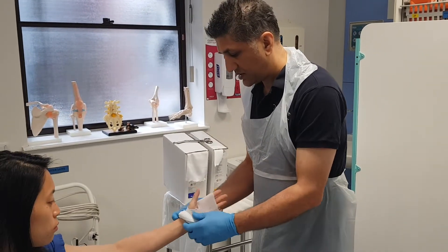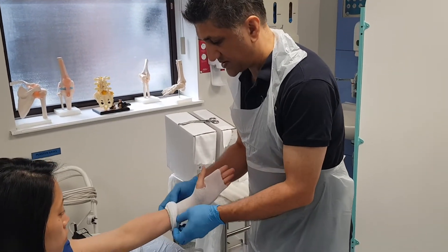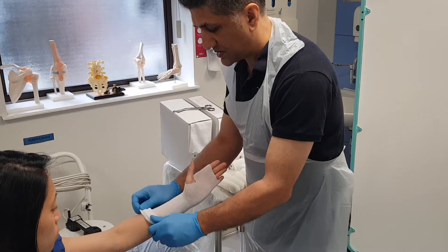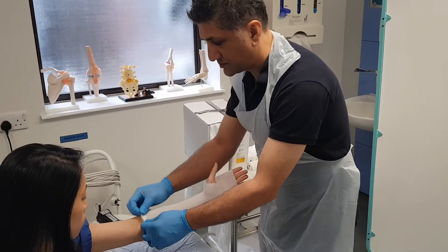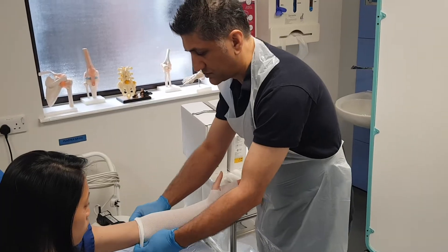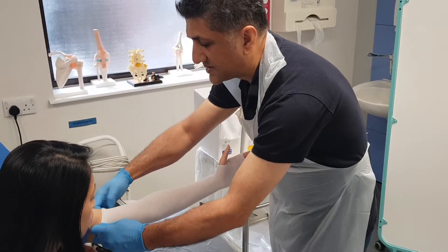I want to go down to the metacarpal heads and unroll this all the way up to the axilla.